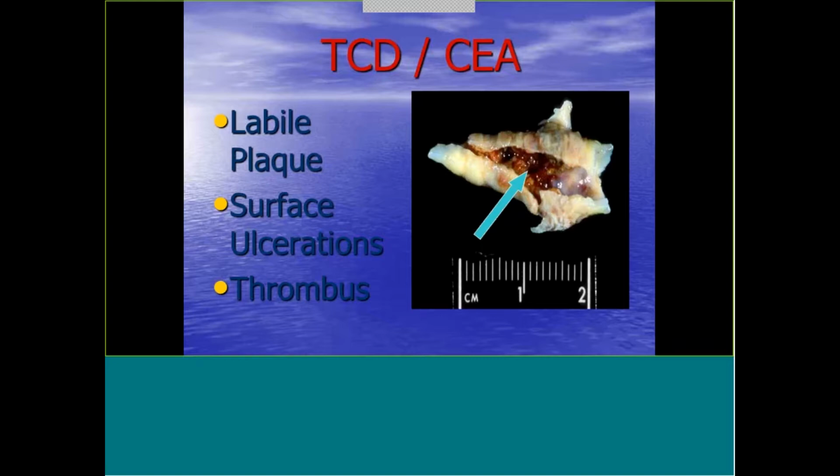Find the window again, because you have it marked. Get out of their way. These cords are long enough on these probes that you can be away from anesthesia, not in their space, but still be in their space if you need to be. So you want to listen for emboli from the very beginning. You don't want to put it on and say, call me when they're ready to clamp. And I'm going to tell you why.